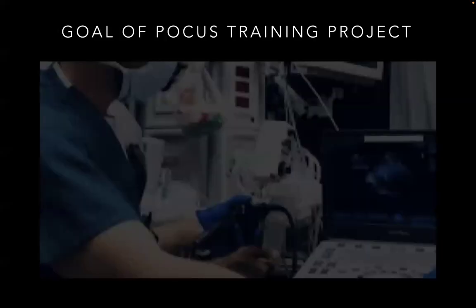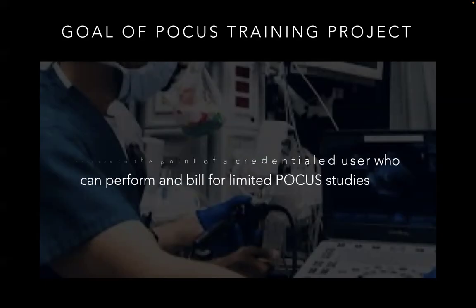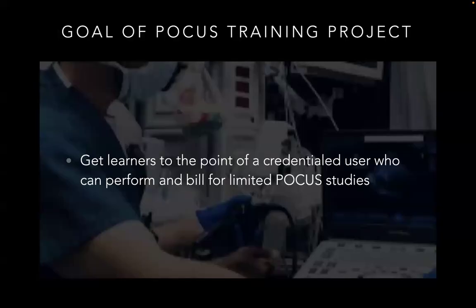So the goal of today's primary care POCUS workshops and the training project is really to get learners to the point of a credentialed user who can perform and bill for limited POCUS studies. That's definitely the ultimate end goal. However, also just to get an introduction to POCUS and what POCUS can offer in the primary care setting, that's my goal for these sessions.